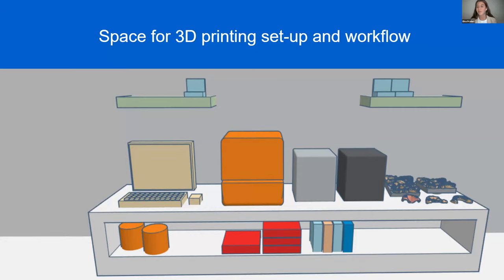But we also have dentists that are now using their printer at home, just testing out. So it's desktop size, but for practice overall, it's good to have a dedicated space. So yeah, that's it for me.